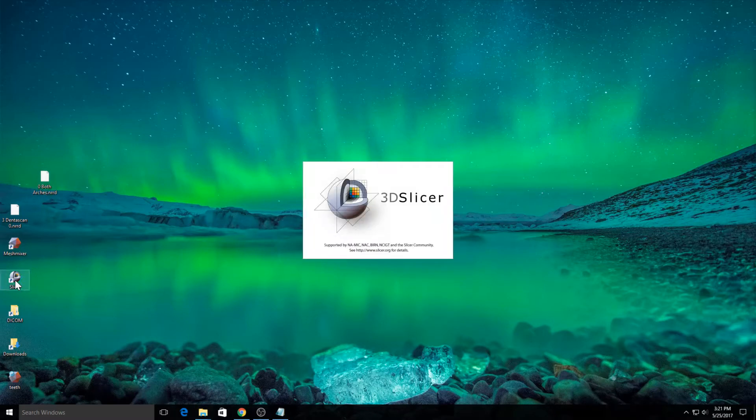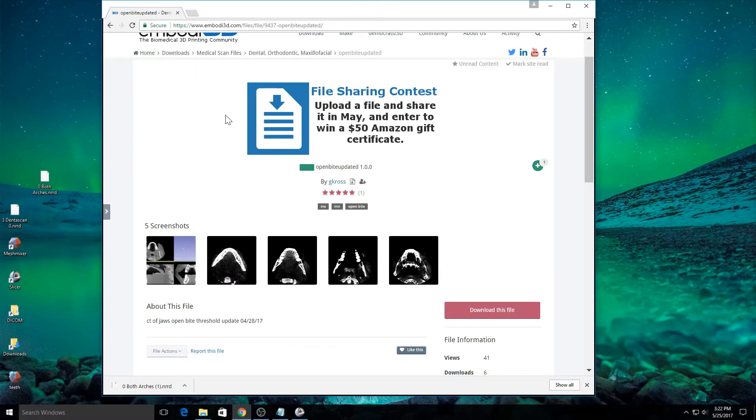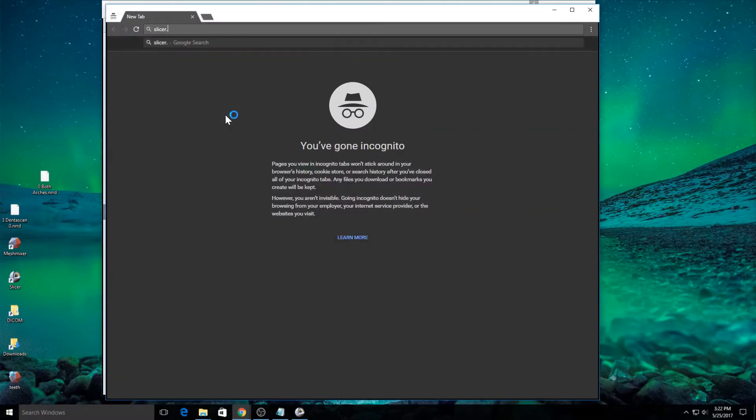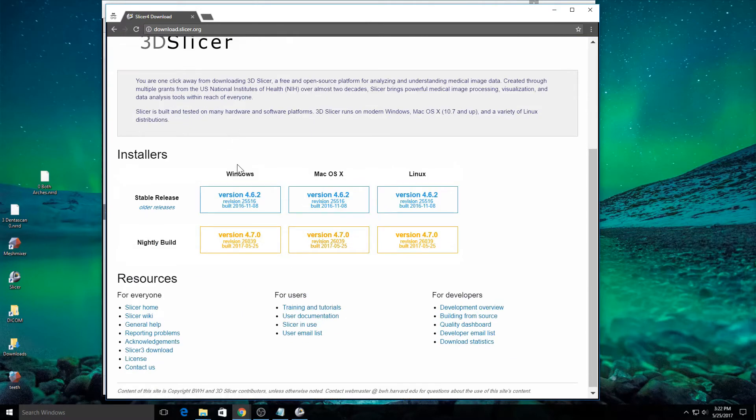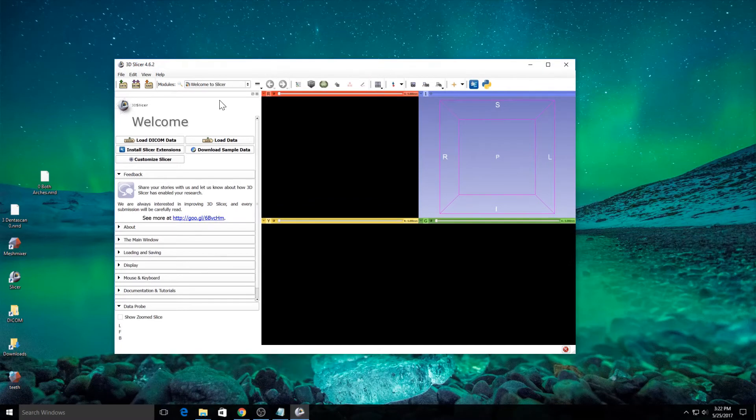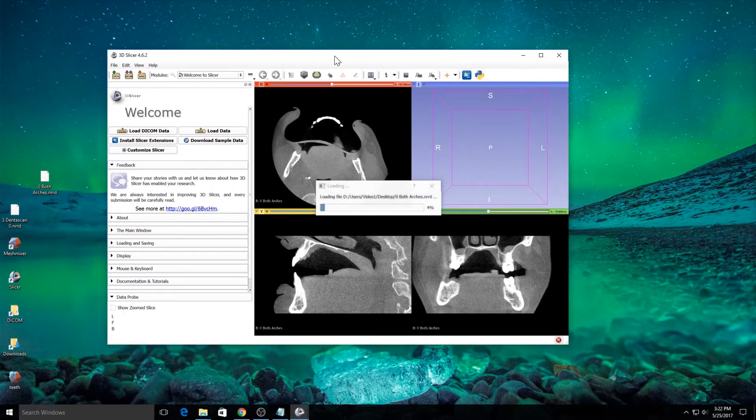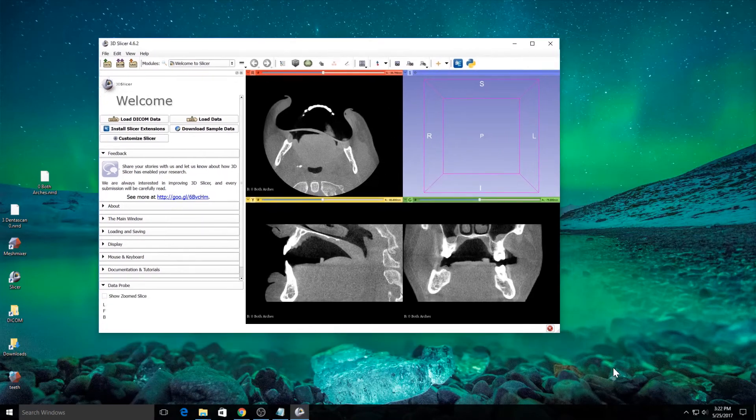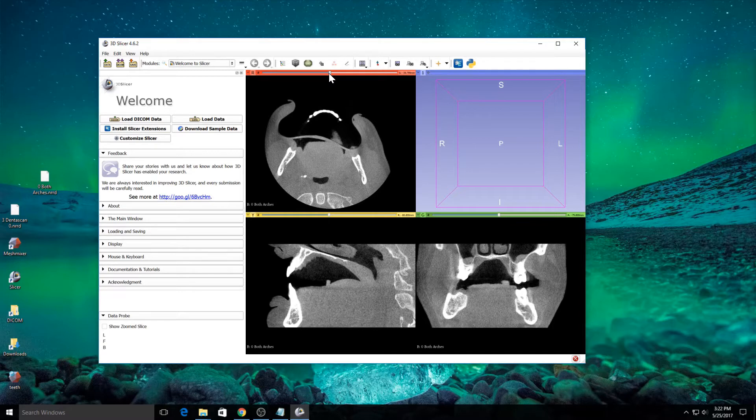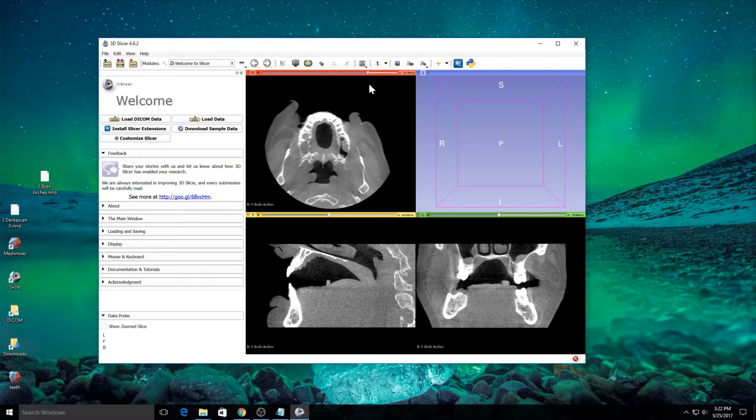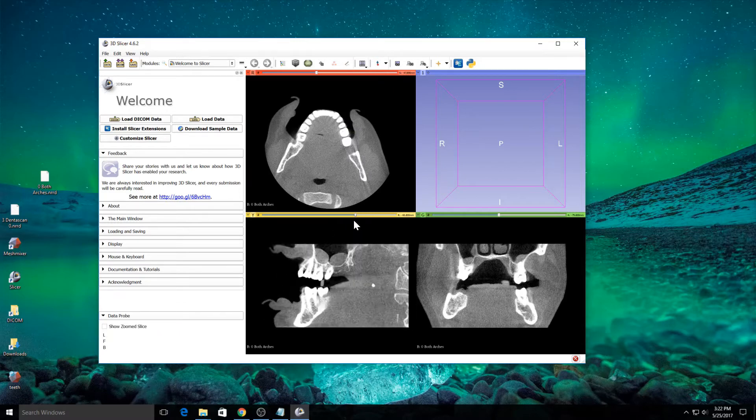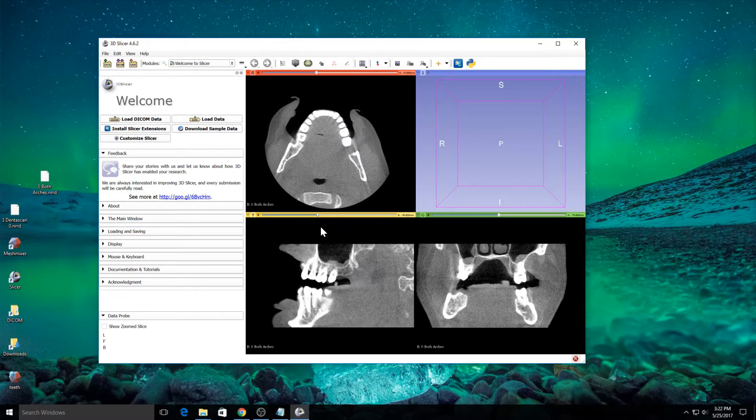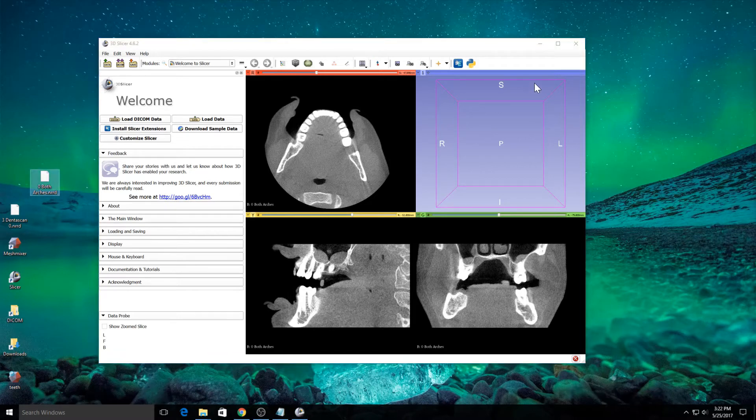I'm going to open this software program called Slicer. If you don't already have Slicer, you can get it from slicer.org and just go to the download page and you can download it for any operating system here, Windows, Macintosh or Linux. It's a free and open source imaging software program. I've opened up Slicer. I'm going to take this arches.nrrd file and drag it onto the Slicer window. Click OK. And Slicer will open it up. You can see that this is a really good quality scan that's going to be perfect for our purposes of creating a dental 3D printable model. That looks pretty good. I'm happy with that.